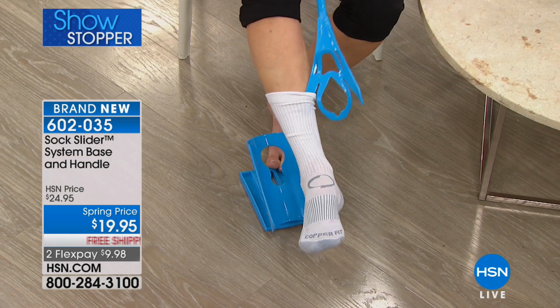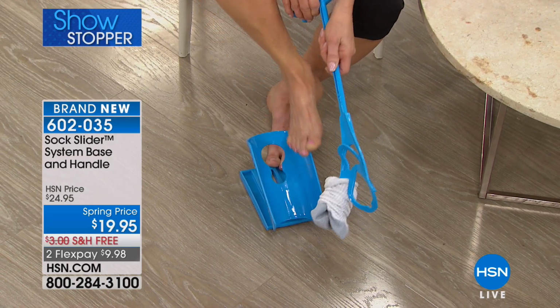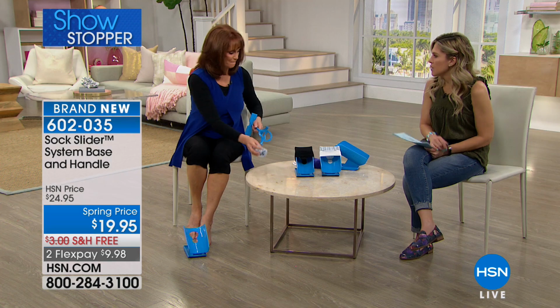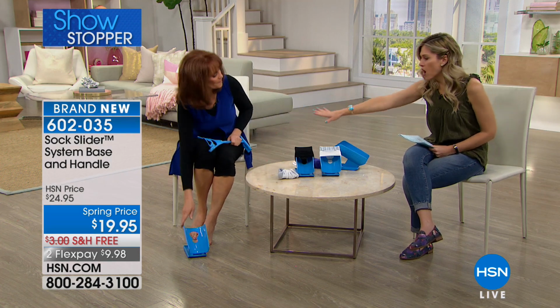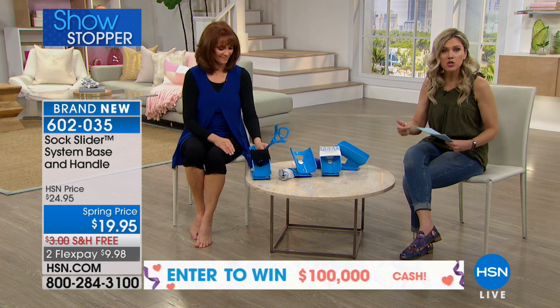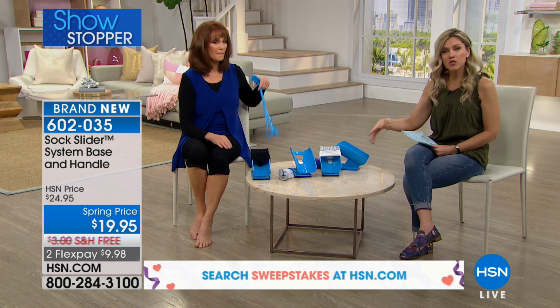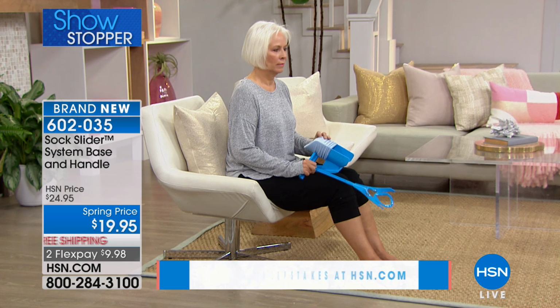Now, I can take this and take my sock off as well, which is great when I can't bend at night. Yeah, I mean, it really is. The wand is like an extension of your hand and your fingers. That's what you'll be using to put on and off. When the sock sliders, that's what you put the sock on. That's that base. That's what makes it really simple.